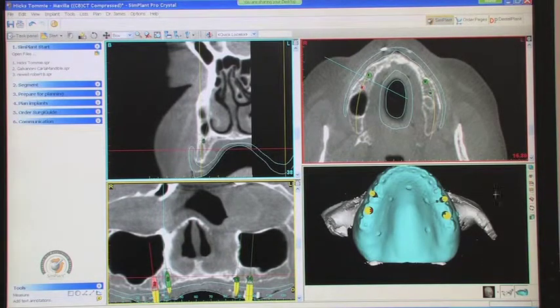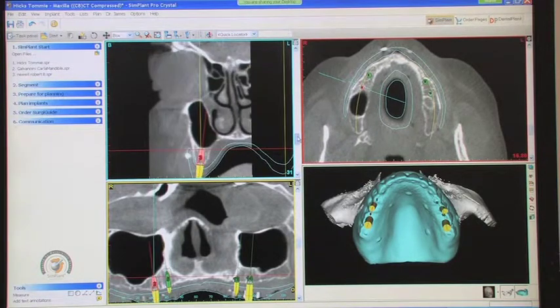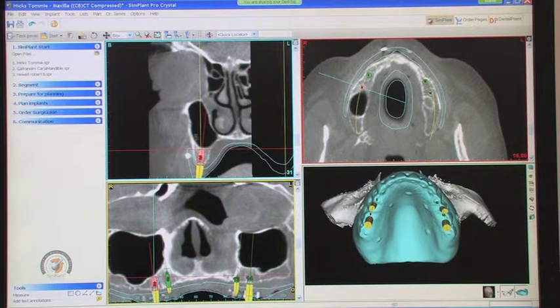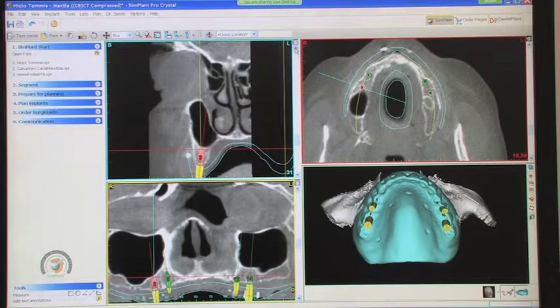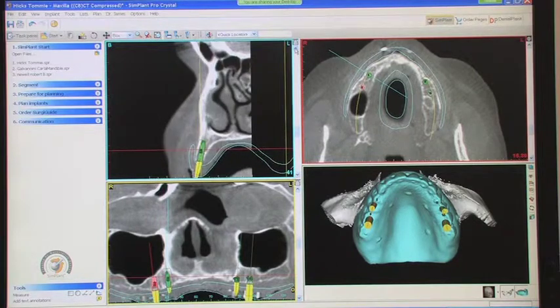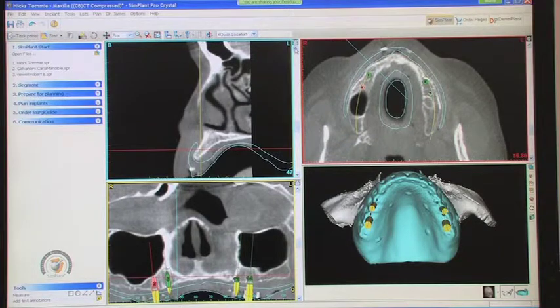We've tentatively dropped some implants in where we could find some bone, and that may change the way we go here. Let's start on the patient's upper right in the number 3 area and walk around the arch. You can see the number 3 area has some bone, but going mesial into the number 5 area it starts getting a very, very knife-edge ridge.